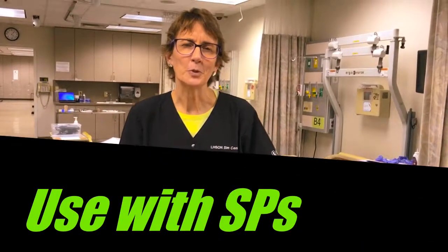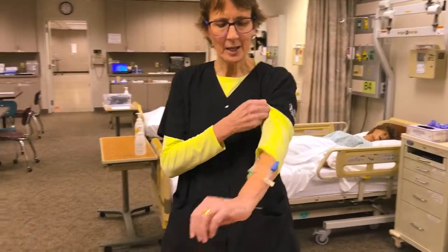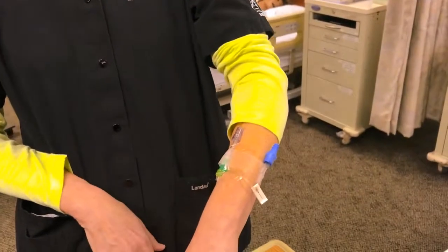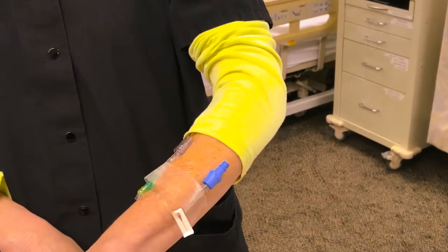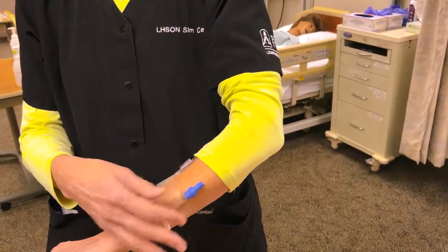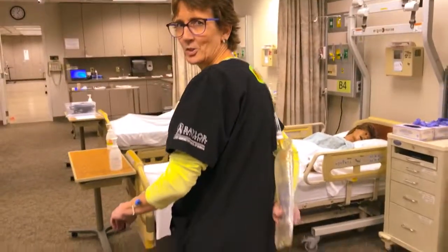Another idea we're pursuing as far as use of the simulated IV bypass system is with standardized patients. You can see here how easy it is to go ahead and apply the simulated IV bypass system to a live actor, and thereby creating the ability for students to go ahead and administer fluids and or medications via the simulated IV bypass system with its drainage bag.